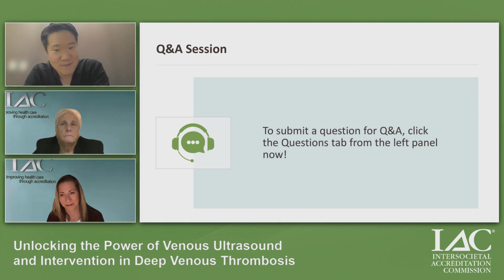So some patients have DVT throughout their leg and it's extending into the tibial veins, and they need work done on their tibial veins too. And some of those devices go into the tibial veins. They're small enough to get in there. They're small enough to make a difference. So there may even be intervention for some of your patients with tibial vein thrombus.